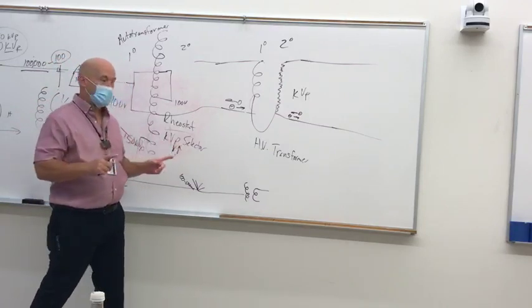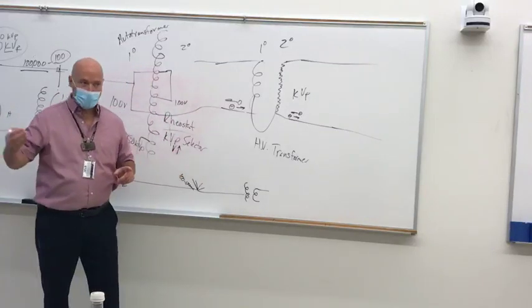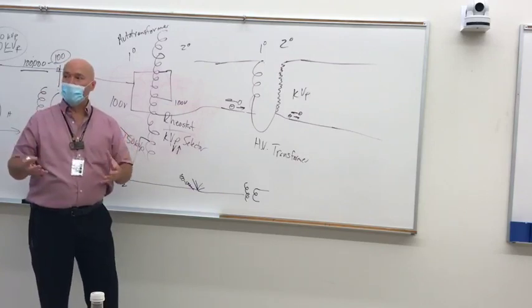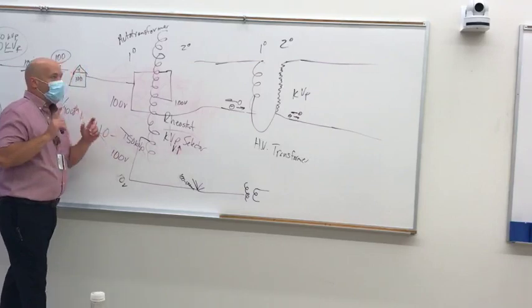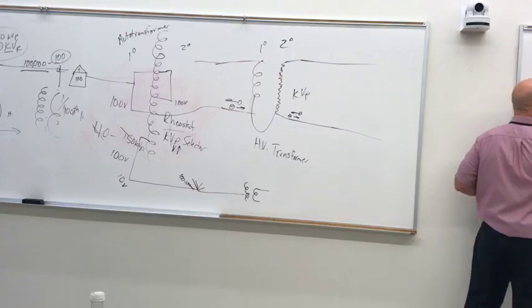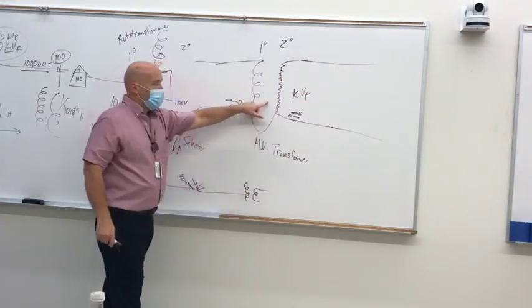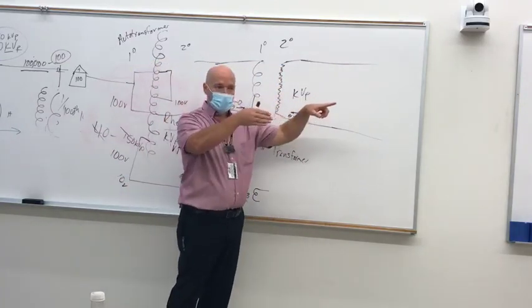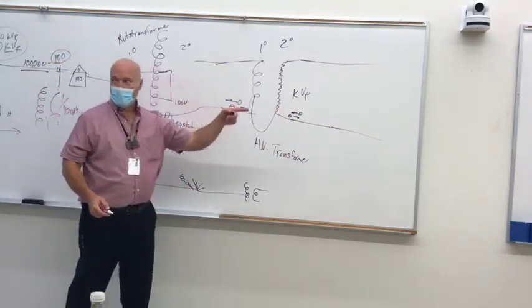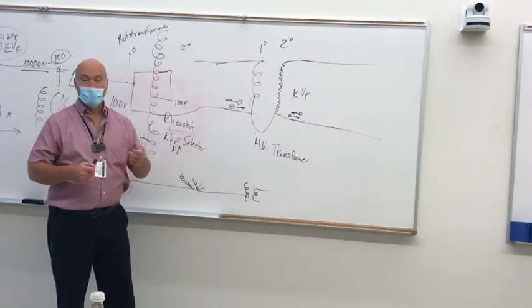So potential. We've got electric potential. If we get a lot of electrons, you got a lot of potential difference, a lot of electric potential between you and the doorknob, and then it jumps. But you got to have a lot of electrons to create that voltage. What we don't want is, once we get electrons here at the filament, we don't want them to jump across the tube until we're ready for it. If we apply kVp to that right away, it goes across the tube. It's a lightning bolt. But if we only have 10 volts going through it, what's the likelihood that it's going to jump across the tube? Not much. Very good.